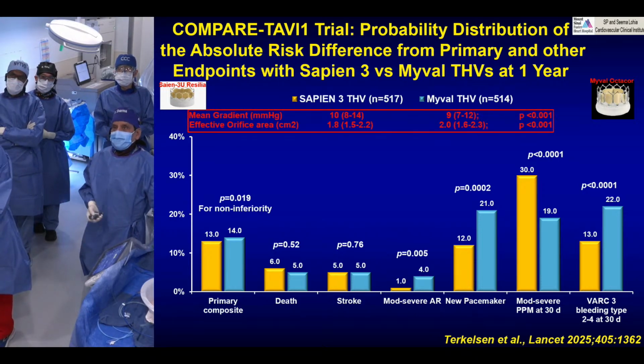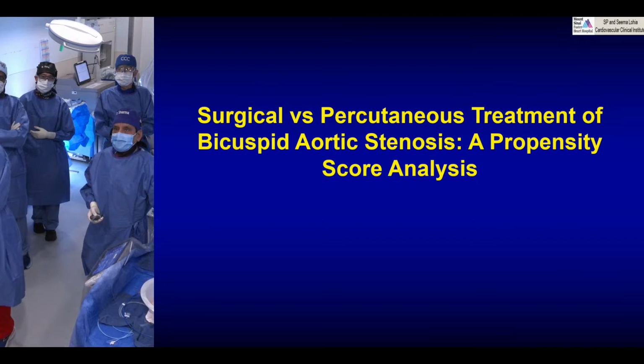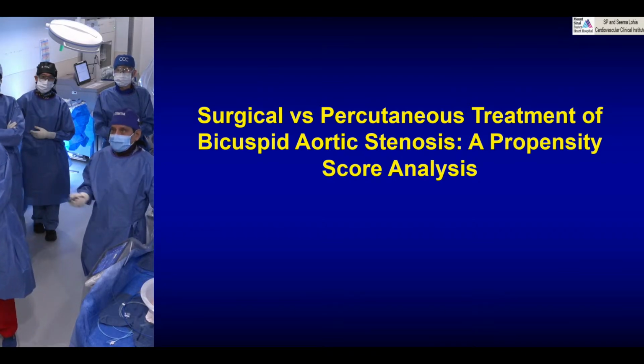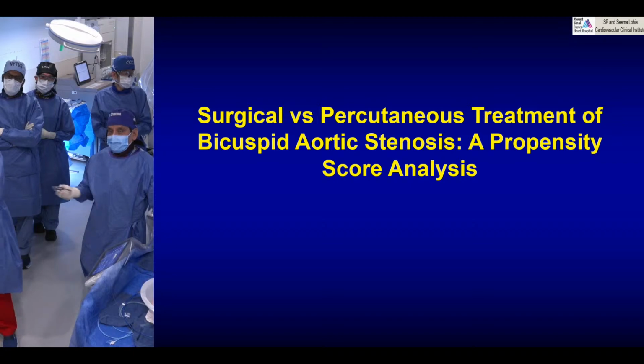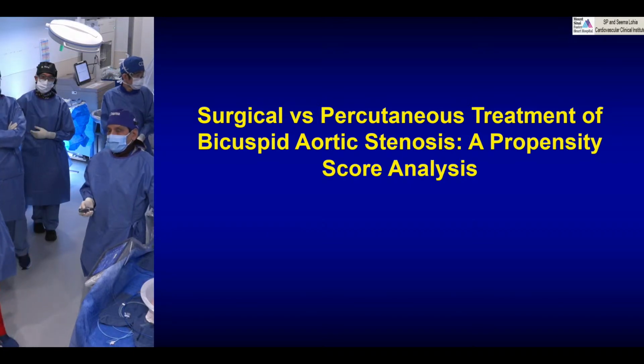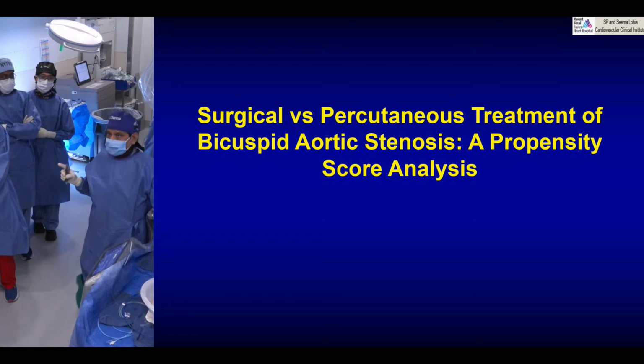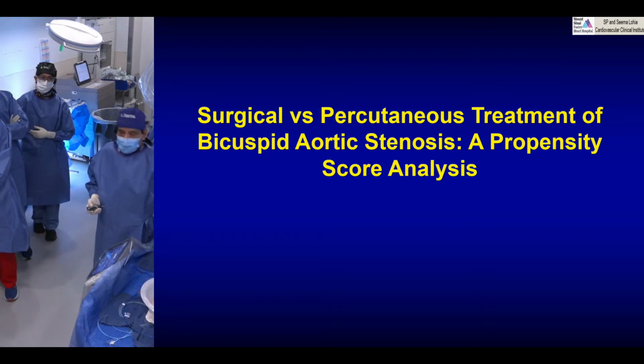And this is the valve that will hopefully come soon to the United States, which will cut down the cost of this valve. That's why it has been so popular in India and Europe, actually many places. They have deployed 44,000 valves globally, 44,000. I thought it would be about 30, but I called them today and confirmed it: 44,000 MyVal valves have been deployed globally at present.